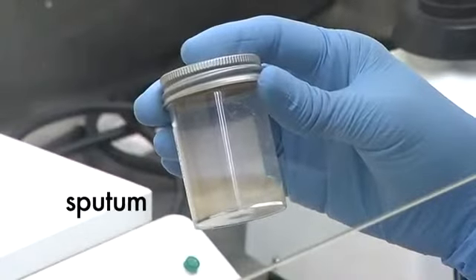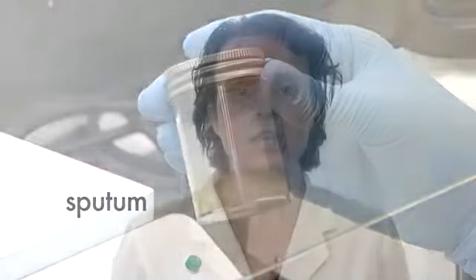The most common sample sent for the investigation of Mycobacterium tuberculosis is the sputum sample. Mycobacterium tuberculosis is a slow-growing organism, and other contaminating normal bacterial flora in a sputum sample would occur if the sample was cultured directly. Sputa and other samples that contain contaminating bacterial flora are decontaminated with sodium hydroxide prior to culturing for mycobacteria.